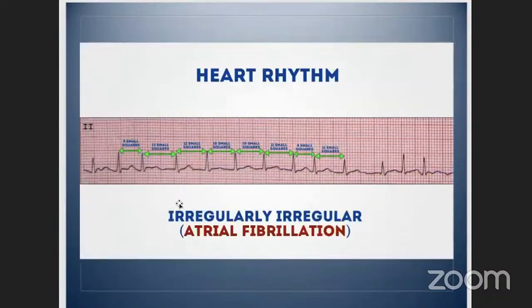Okay, then rhythm. Rhythm is easy, and as junior clinicians, we just know when it's irregular, and we are easily able to identify and diagnose atrial fibrillation. But sometimes you could have a young person or a fit, healthy person who has a sinus arrhythmia, so it would fluctuate with breathing.